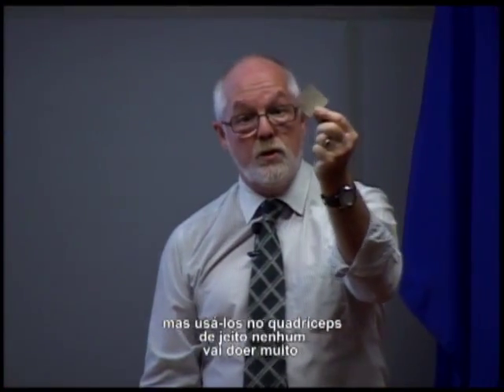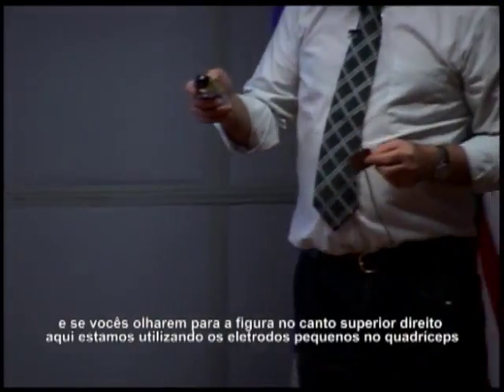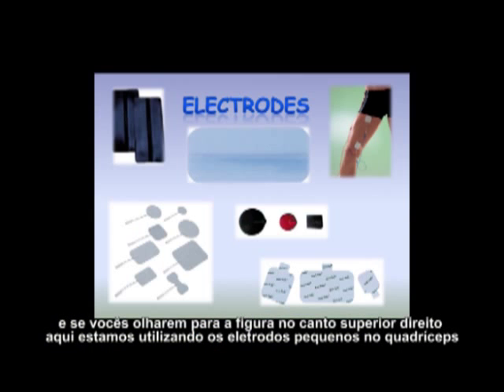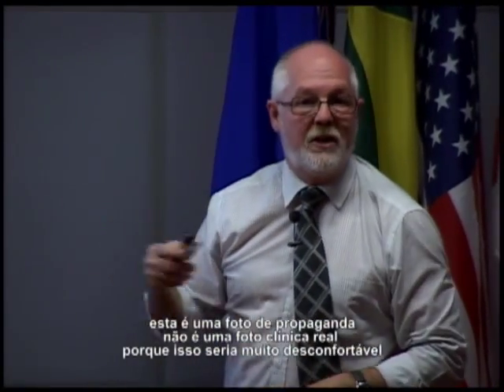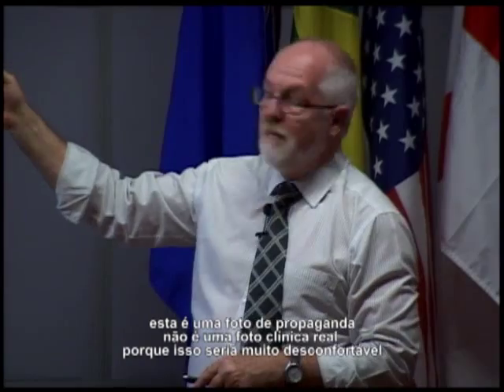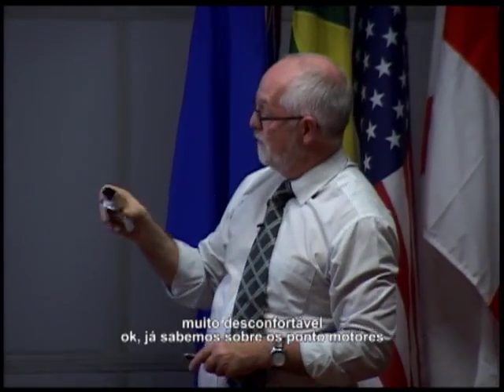But use those on the quadriceps, no way, because that will hurt a lot. All right? And if you look at the picture up on the top right, this is using those small electrodes on the quadriceps. It's an advertising picture. It's not a real clinical picture, because that would be very unpleasant. Very unpleasant. Okay.